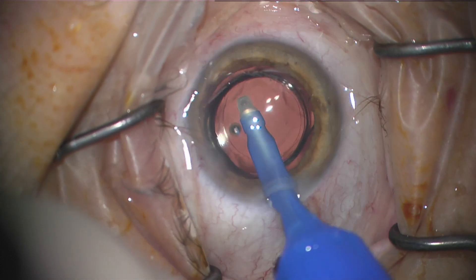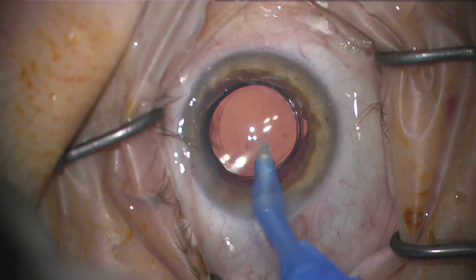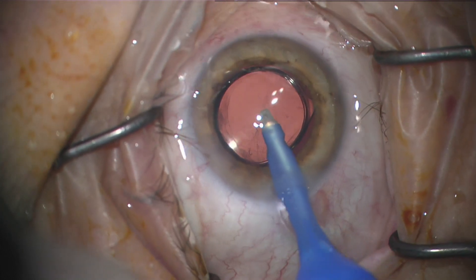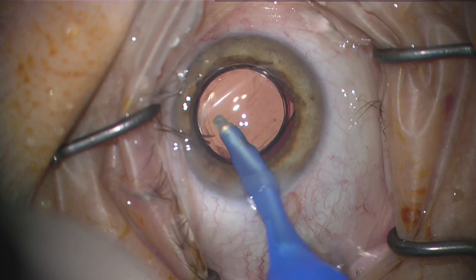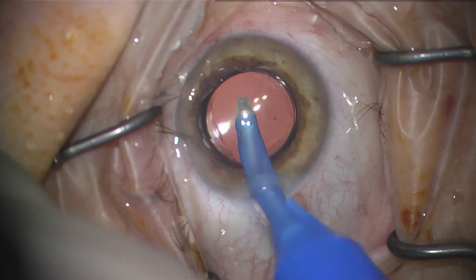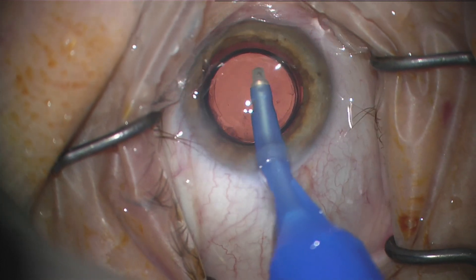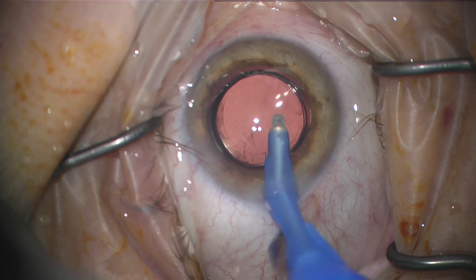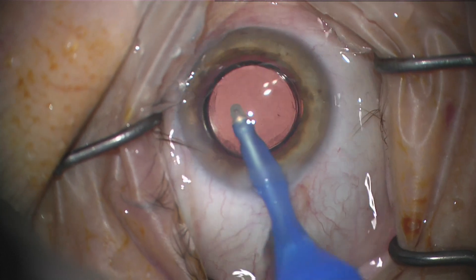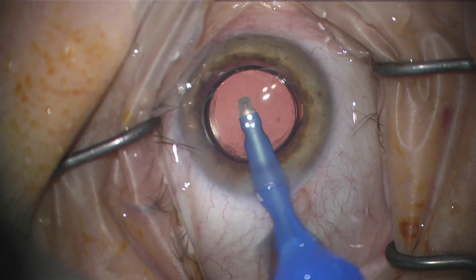It worked — no complications, no issues. I have not broken a posterior capsule with it so far. Try to use it on softer lenses, the ones that are pre-choppable in general. It's just a little easier because you can't really sculpt with this thing — if you're trying to break a lens you need to eat right into the center and then chop it, either horizontal or vertical. Vertical chop is a little hard with it, but if it's pre-chopped already it works great.